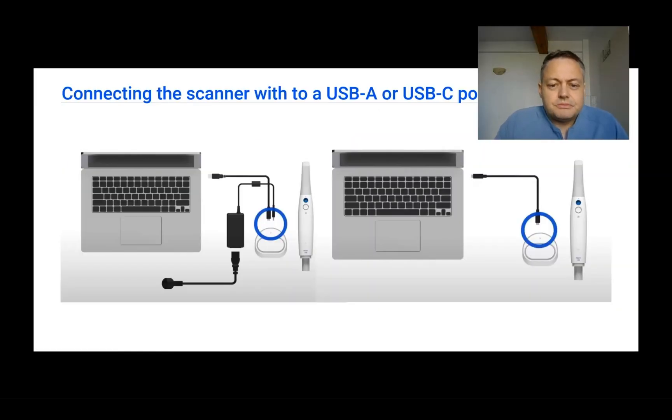After you have placed the tip on the scanner, now it's time to connect the scanner to the computer. To connect the scanner to the computer we need to connect it to either a USB-A or USB-C port.